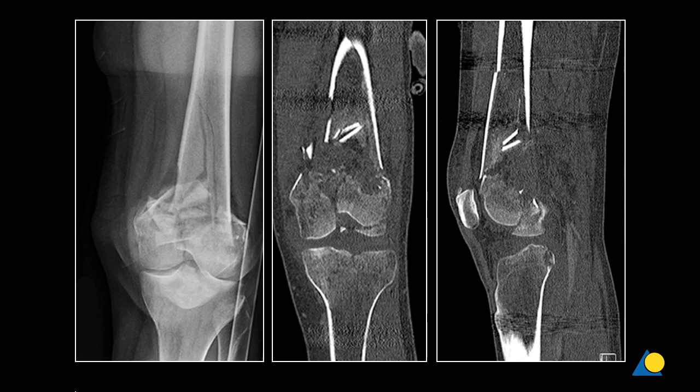This 23-year-old female patient was involved in a high-speed road traffic collision, sustaining multiple injuries, including a complex intraarticular fracture of the left distal femur. The CT scans confirm multiple displaced fragments at the femoral articular surface, including a coronal plane Hoffa fracture of the lateral femoral condyle.